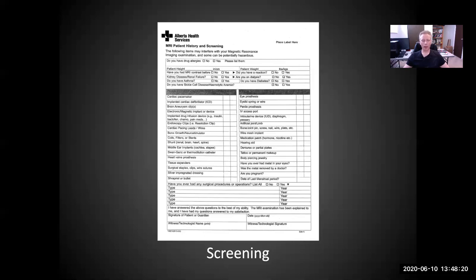a cardiac pacemaker. And on the left-hand side of this form, you can pretty much say that all of those are red flags. In other words, it's some kind of technology which would either stop working because of the main magnetic field. For example, a cardiac pacemaker would simply stop working. Or else it would be something where we'd be concerned that movement of it, torque or translational movement of the metal object like shrapnel, could potentially cause them harm.